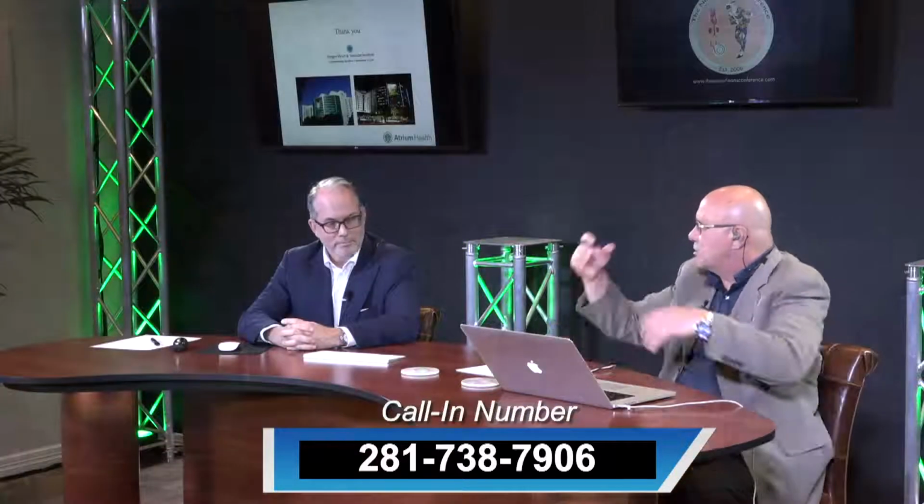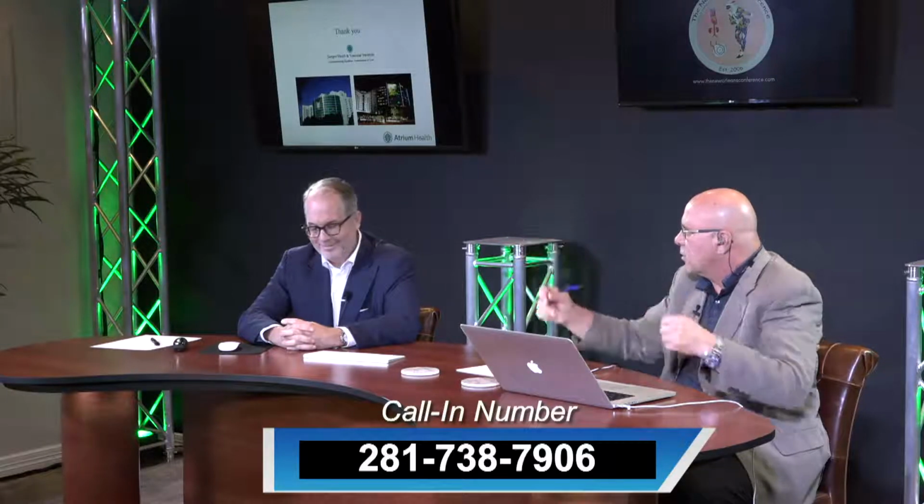You've got some folks down in the med center over at Memorial. In fact, Dr. Gregoric, he uses just squeeze it in, clear cardioplegia, crystalloid cardioplegia. It works. And then you have another surgeon came into town and he wanted the Quest Micro-Plegia. Some folks I know down in the southeast part use that, but we're using it in some places. And now we're talking about adding the Del Nido solution.